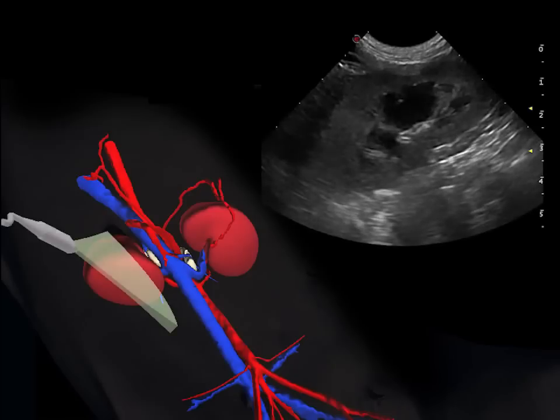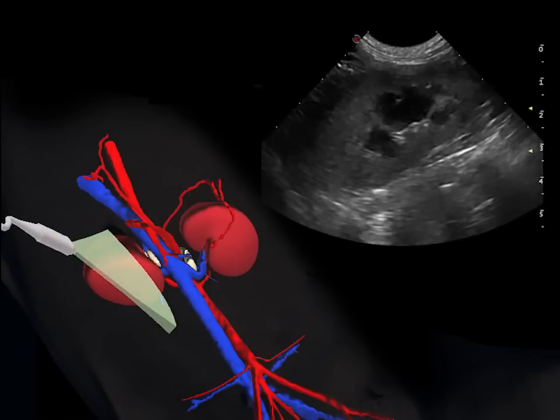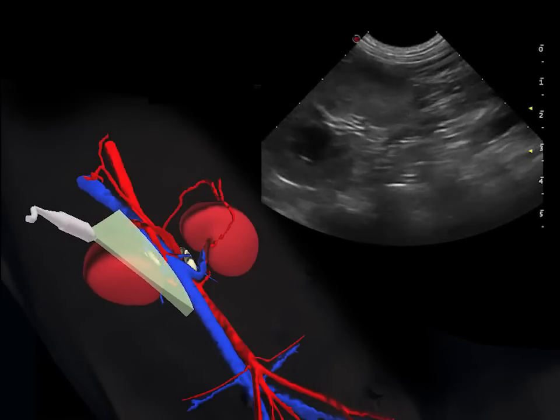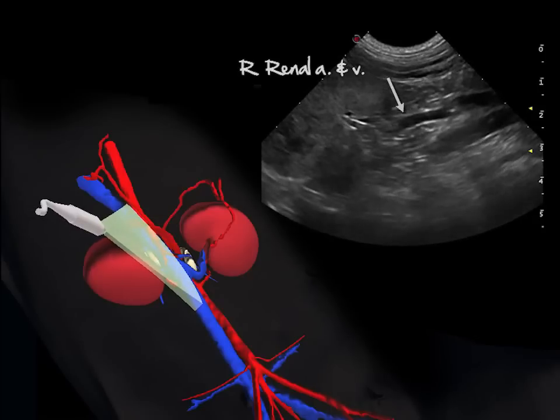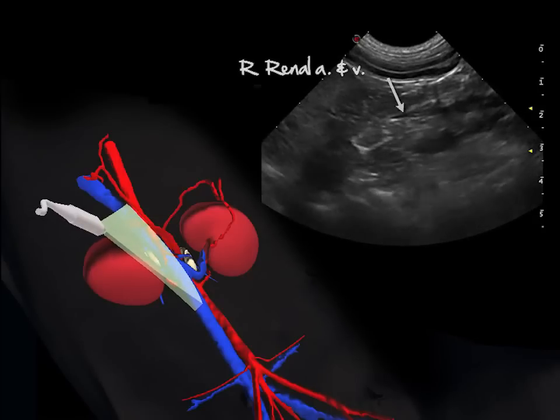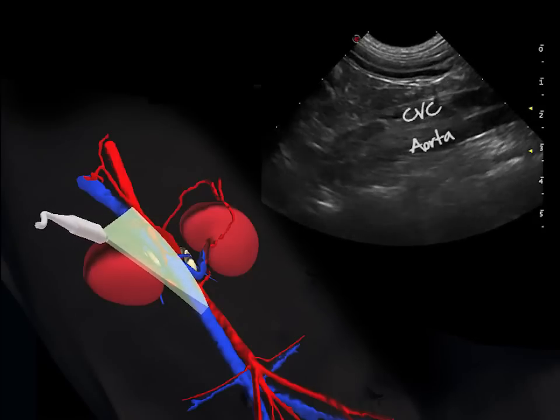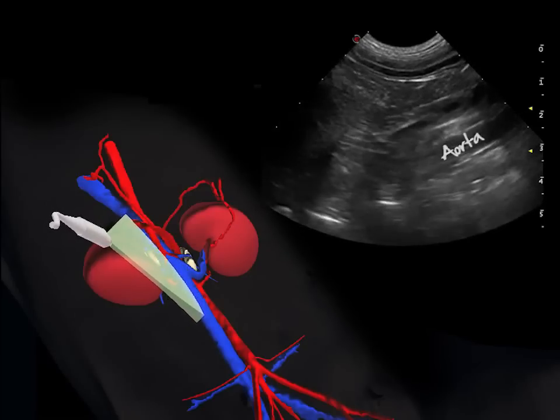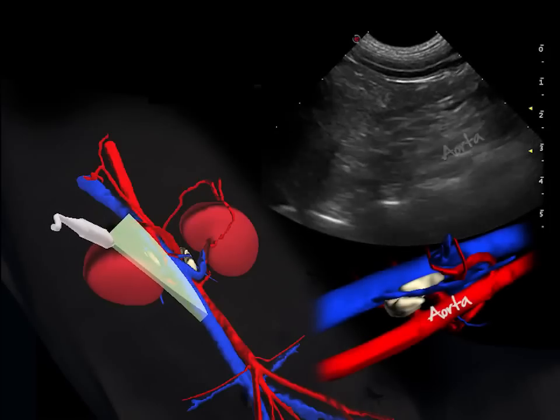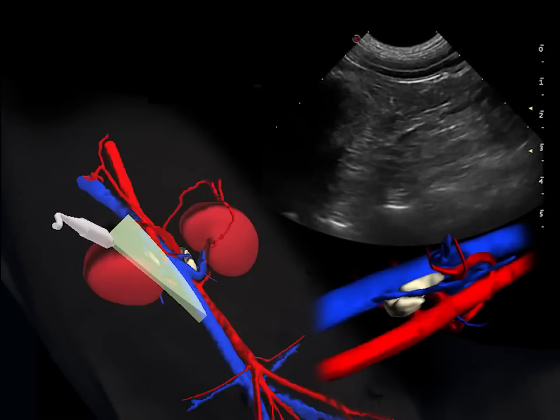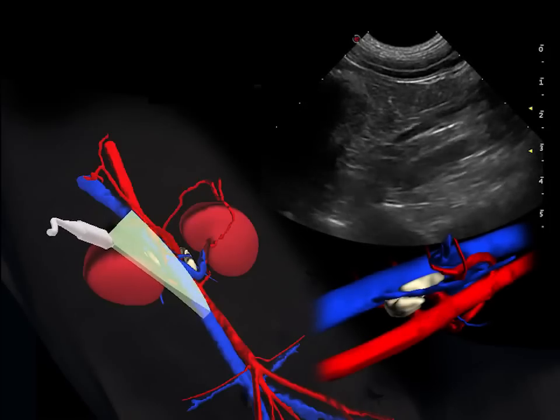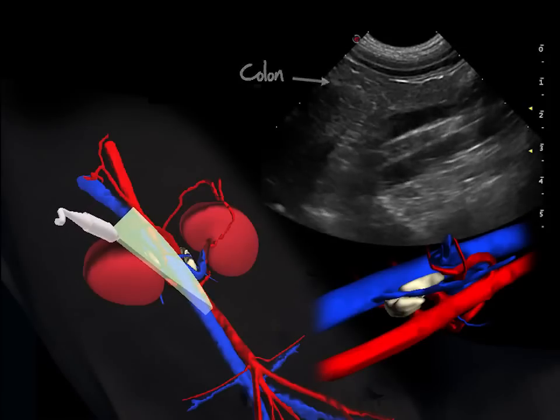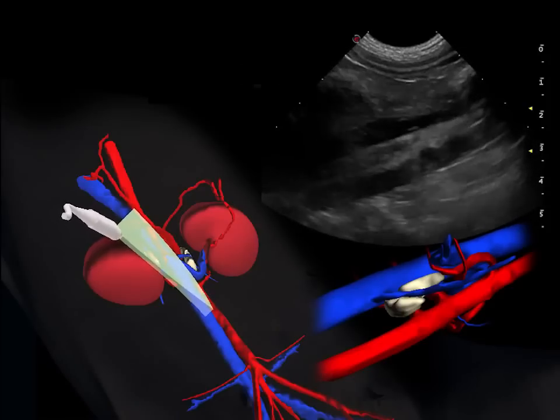In B-mode, follow the same steps: first identify the right kidney, then slide the probe medially while following the right renal artery and vein all the way to the caudal vena cava, just ventral to the aorta. The aorta is differentiated from the vena cava by its obvious pulsation. The feces in the ascending and transverse colon are often a source of acoustic shadowing and reverberation, which will sometimes limit your exam.